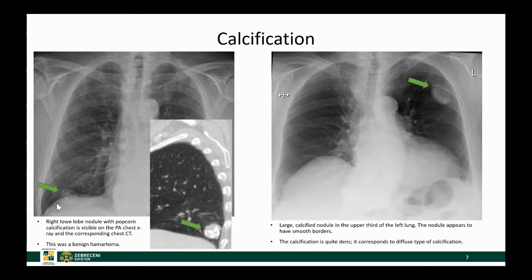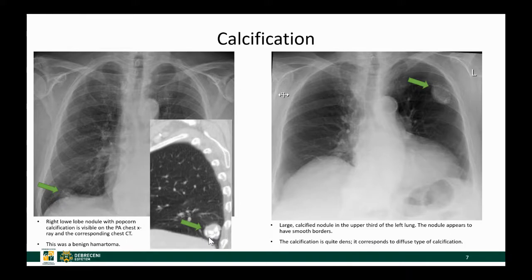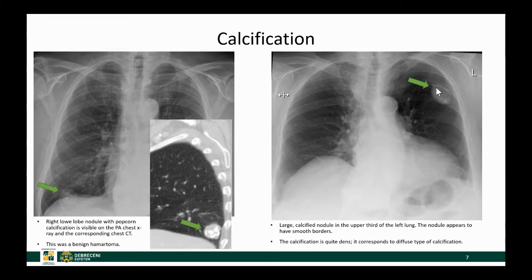Here are some examples. There is a nodule overlapping the right hemidiaphragm — quite large, almost 3 cm — with some foci of calcification that are difficult to characterize on x-ray. A CT was obtained showing the right lower lobe nodule with typical popcorn calcification, confirming it as a benign hamartoma. Another example shows a large nodule in the upper third of the left lung that is almost homogeneously calcified — this is the diffuse type of calcification, another pattern of benign calcification.